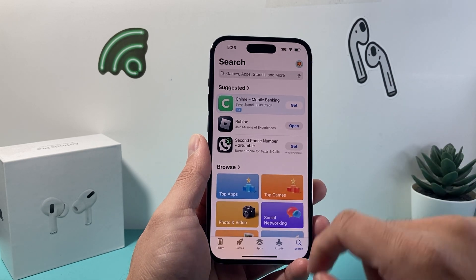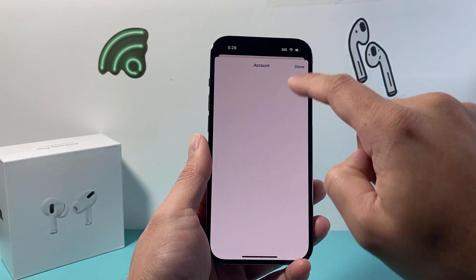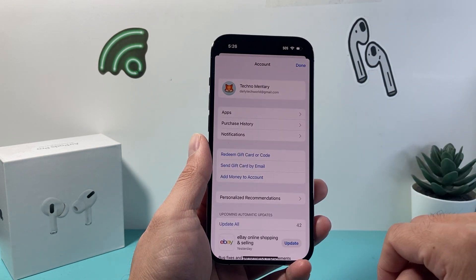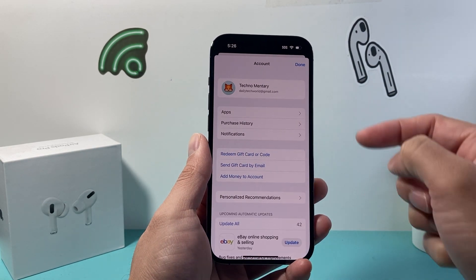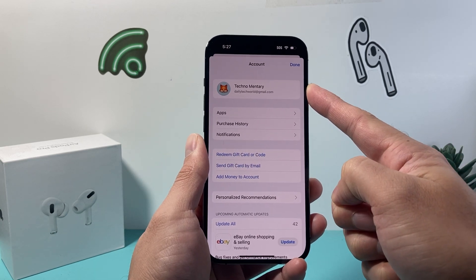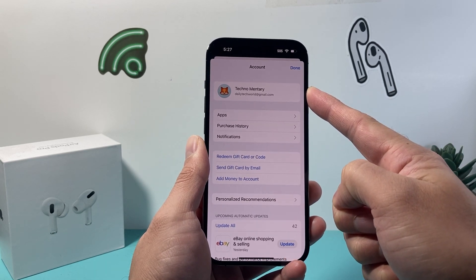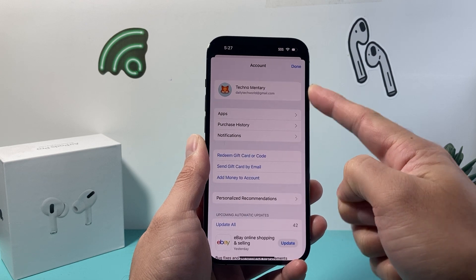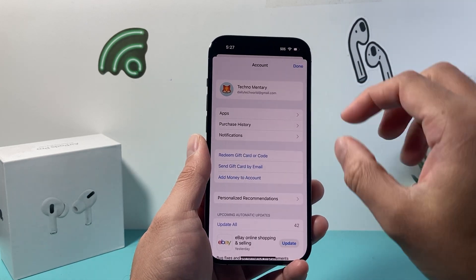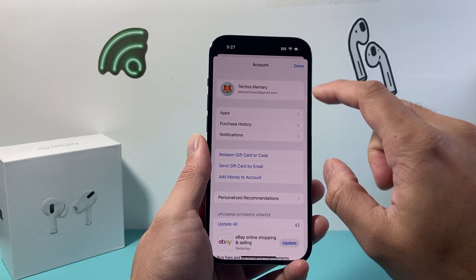Once you're on the app, tap on the profile icon up top and verify that you're signed into an Apple account. If you're not, go ahead and sign in to an existing one if you have one. If you don't have one, you can create one by simply following the steps to create one.